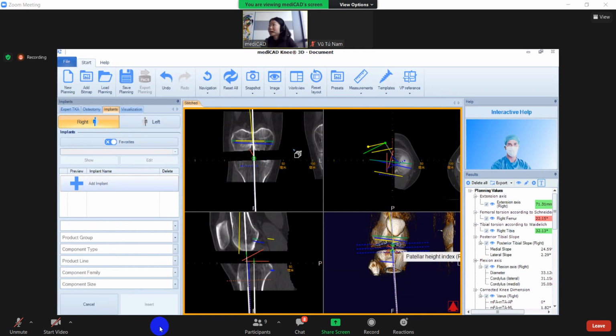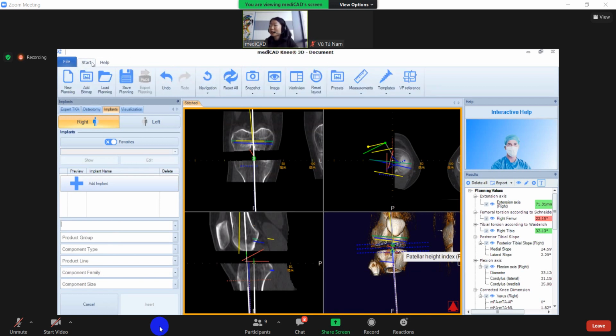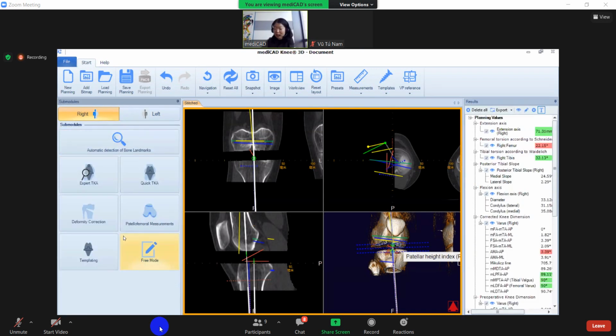Yes. The customized implant is different. I think for the customized implant, you have to give the measurements to the manufacturer, and they can make an individual implant. But let me ask my colleague to answer this question also: how to do the individual implant, okay?